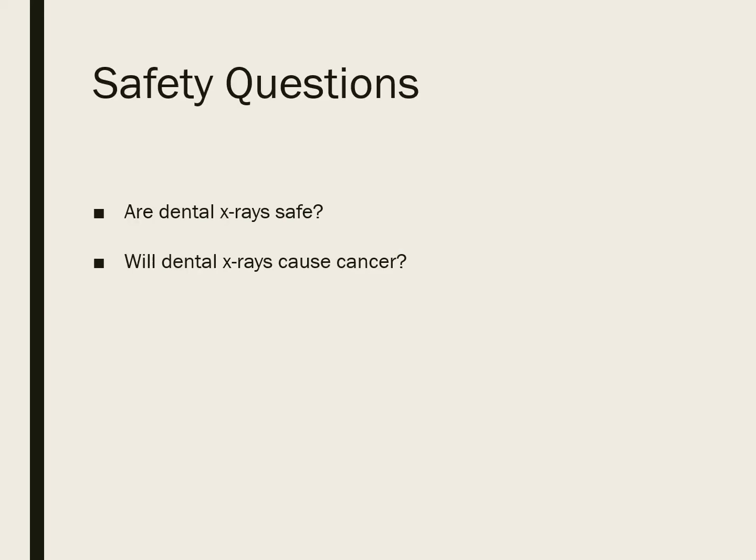All right, and next is safety questions. So, are dental x-rays safe? The answer is no. It's unfortunate, but the answer is no. There are no safe dental radiographs because all X radiation exposure does cause some type of biological harm.